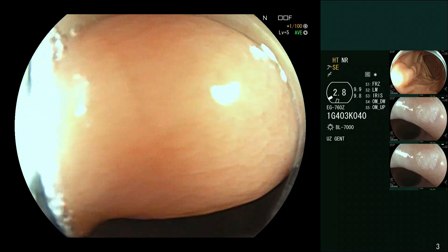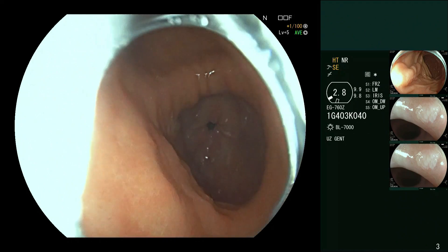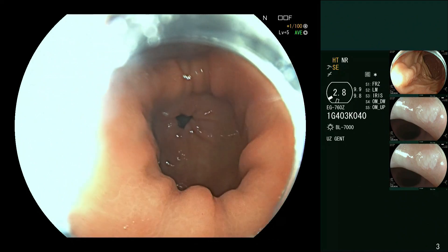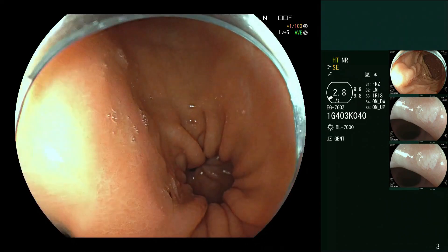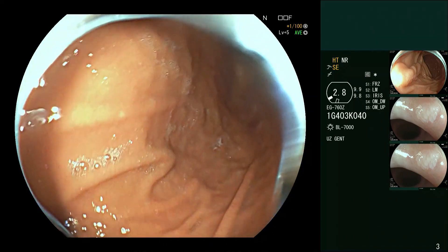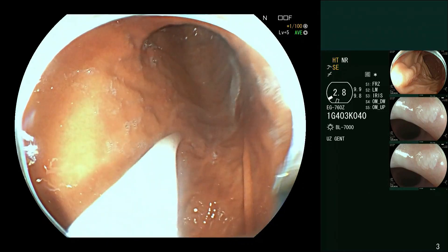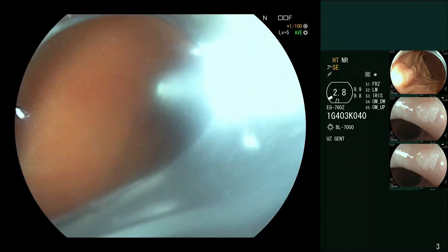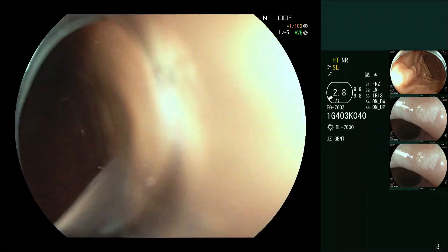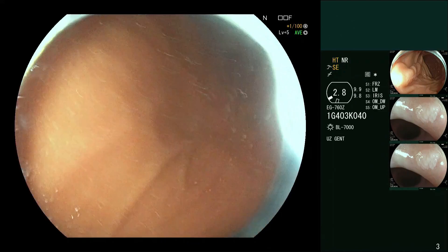There's a cap on, which does restrict your field of view a bit, so you need to have a short cap — and this cap is short — attached to the endoscope. We haven't got great visualization, so we need to improve that. We've got quite a bit of fluid around the stomach body, so we can get rid of that by putting down some simethicone. You can either do this or have the patient drink something before the procedure, which improves the situation.